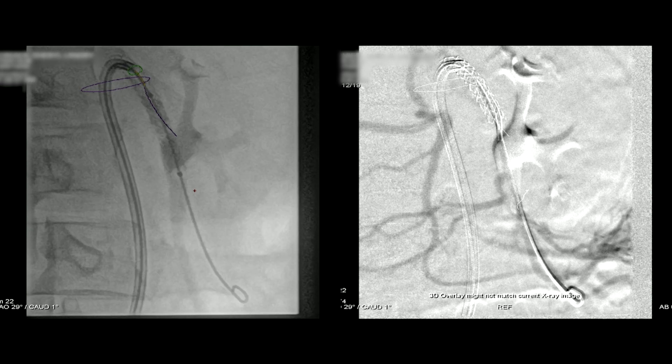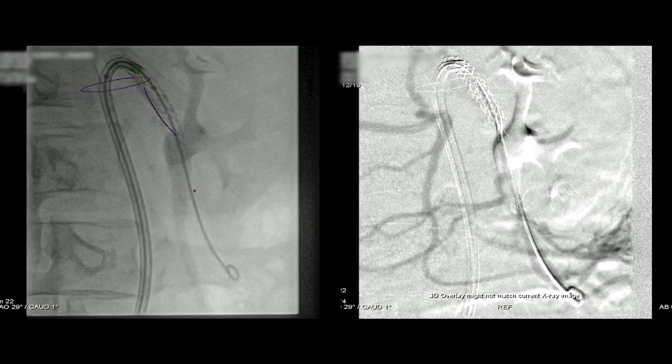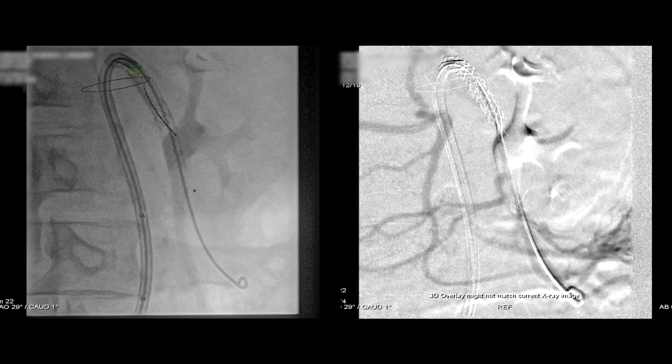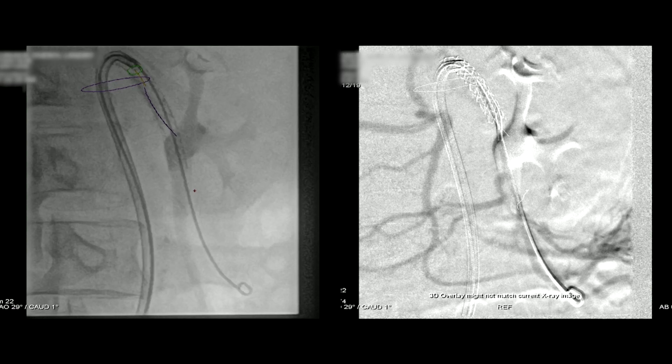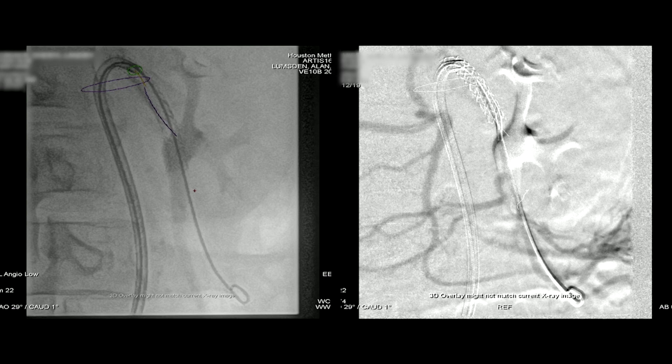We're going to bring the second VBX up into position. The VBX has been deployed and the delivery system has been removed. The Rosen wire is a pretty safe wire because of that little curly Q on the end of it. And then we're going to go ahead and shoot the completion angiogram.